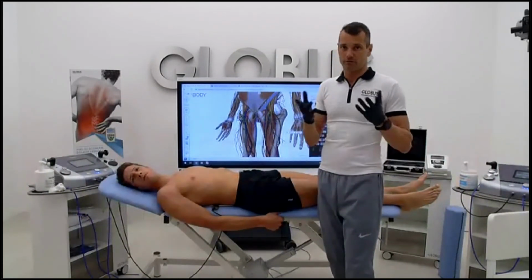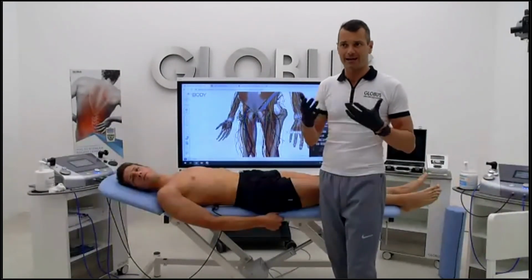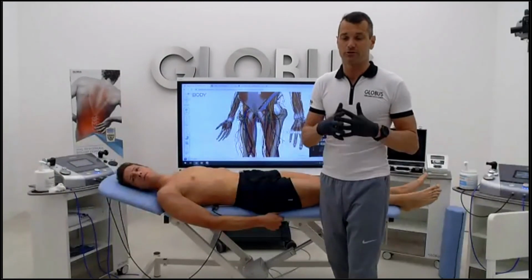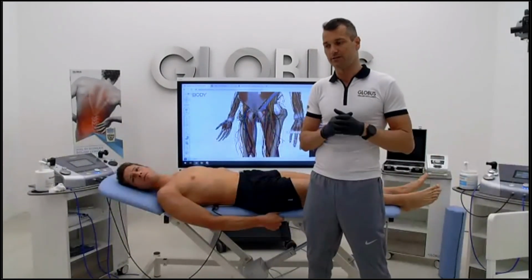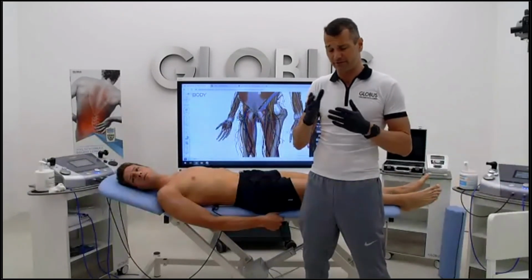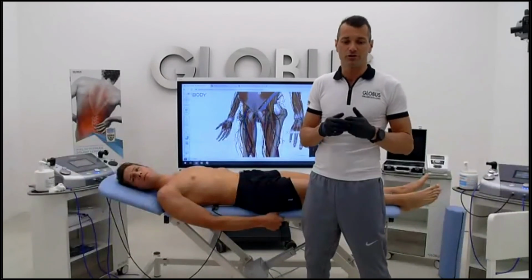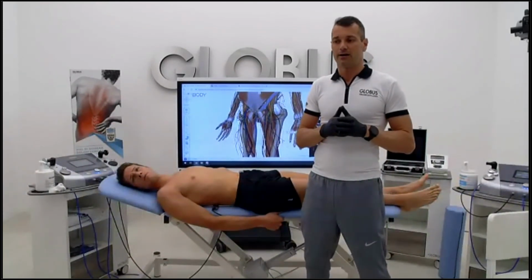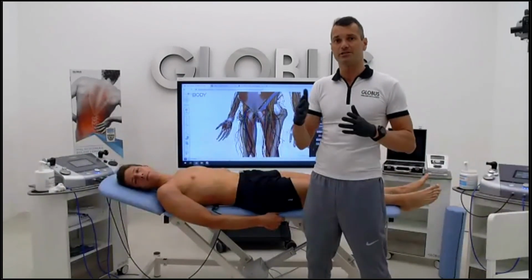Of course, you can combine different therapies, techniques and currents. You have to be sure of the effects of the different technologies on the different pathologies, but I suggest you use one at a time, or evaluate and re-evaluate your patient before each session.